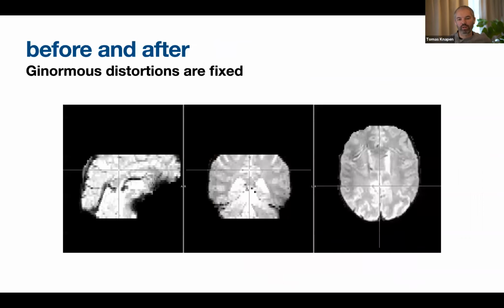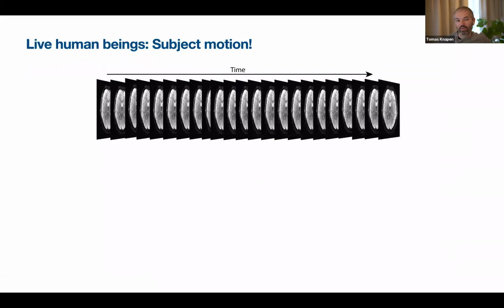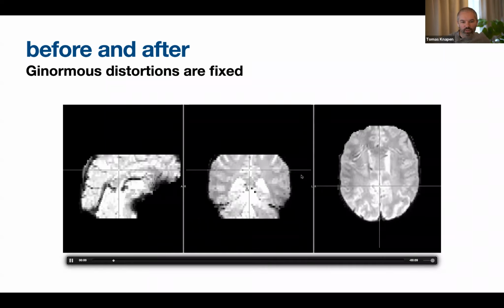And it can be pretty drastic, these sorts of things. This is even still moderate. This is from a 3T scanner; at a 7T scanner, these things can be much, much worse. You really see that here visual cortex shifts at least a couple of voxels. So if you thought something was in visual cortex, it wasn't. And for example, you see the frontal cortex also moving up and down, in and out, very strongly.